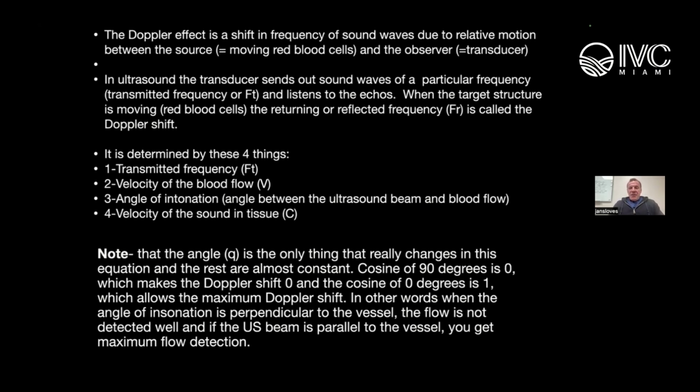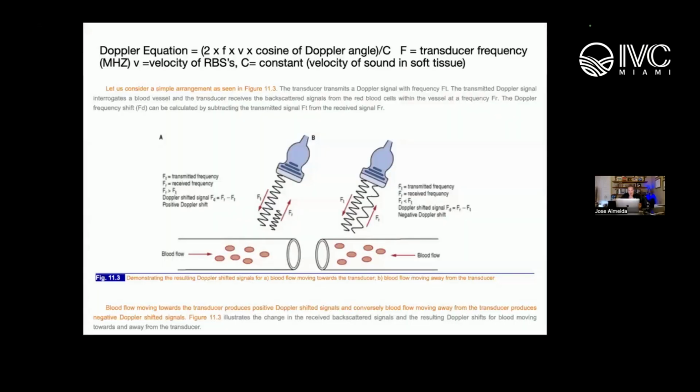With that, the velocity of sound in tissue is 1540 is what they set it at. It's kind of a mean, because in bone, fat and muscle the propagation velocities will differ between those tissues, but they just set it as a constant at 1540. Correct. Yep.